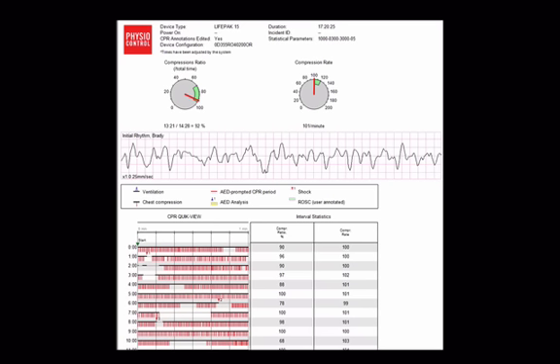So again, there are some things to watch for and to learn from. Things to take away from this are looking at your rates. Are you hitting that goal range? And what can you do to keep yourself in that range? And then how can you minimize unnecessary pauses? Again, there are many necessary pauses, but how do we minimize the big unnecessary ones?